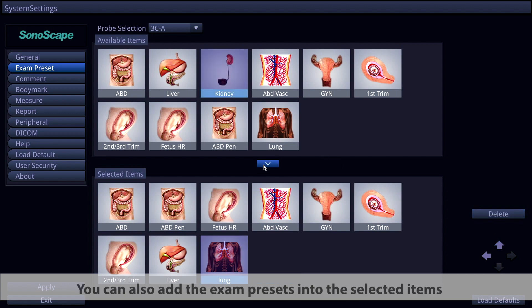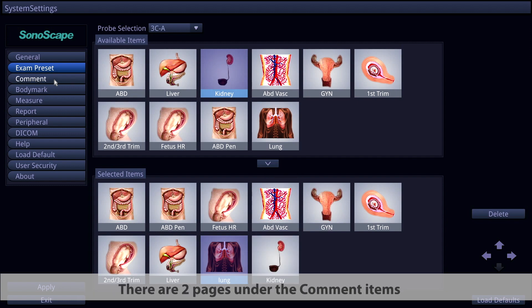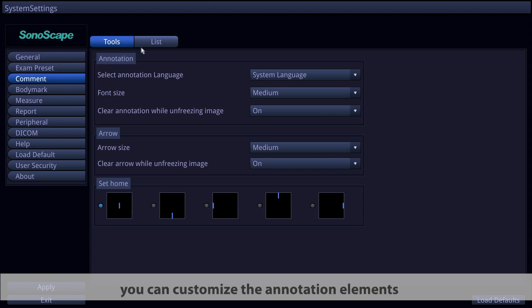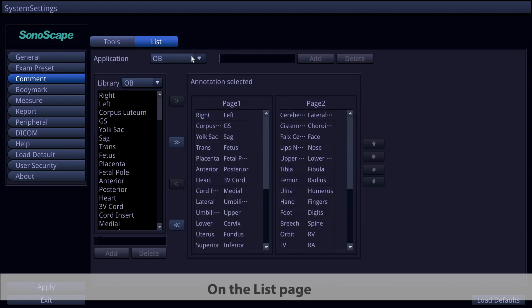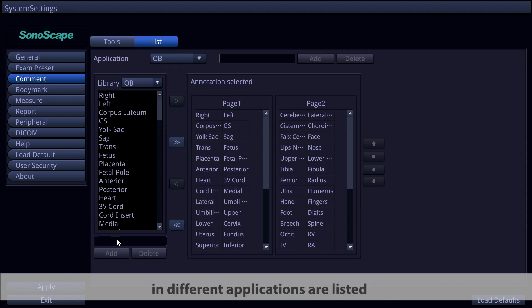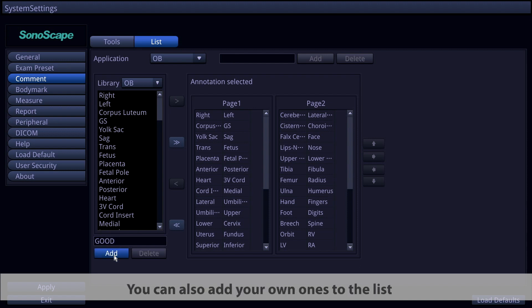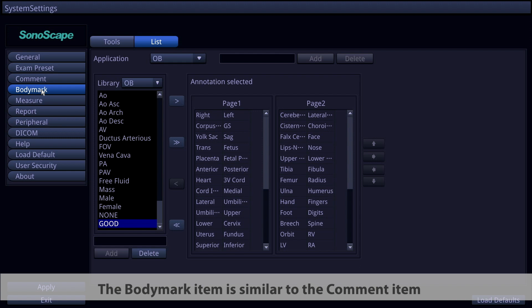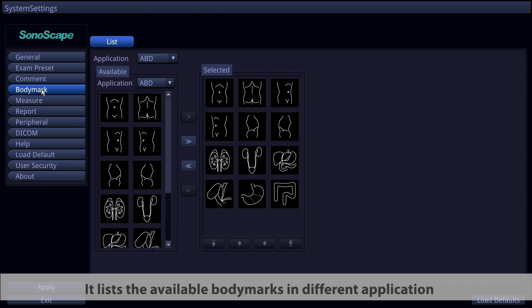You can also add exam presets in the selected items. Under the Comment item there are two pages: Tools and List. On the Tools page you can customize annotation elements. On the List page, commonly used comments in different applications are listed and you can add your own. The Body Mark item is similar — it lists available body marks in different applications.